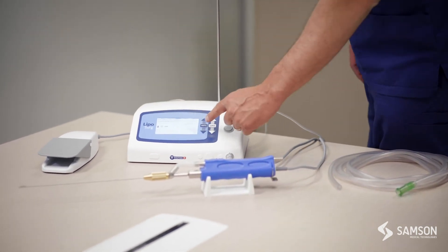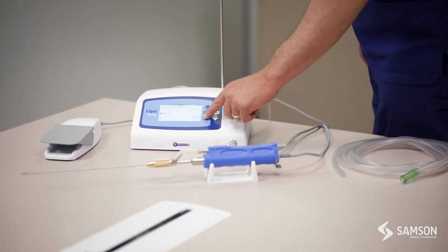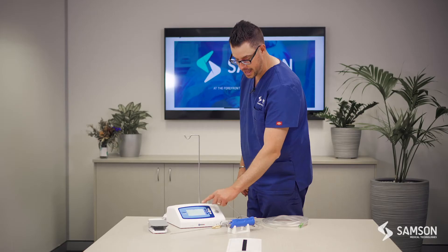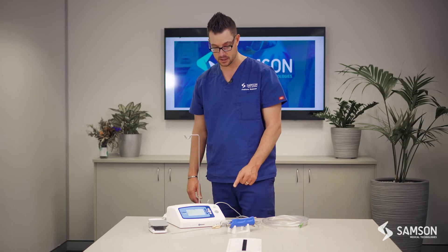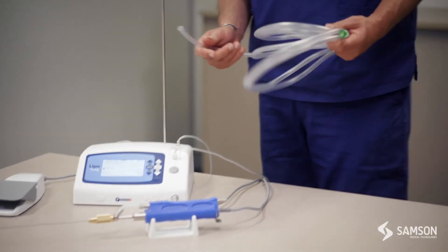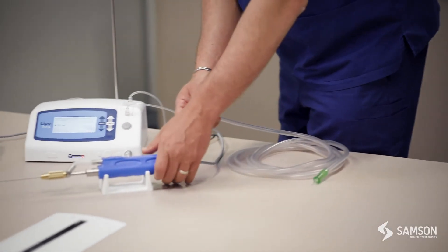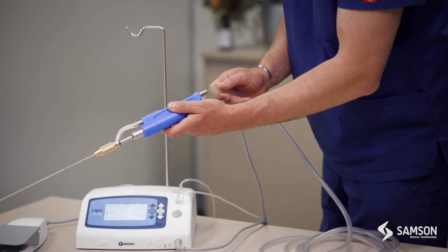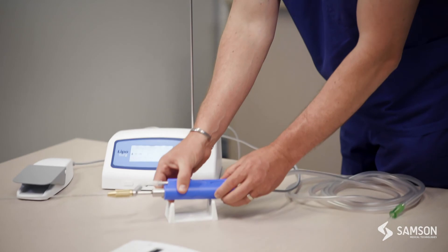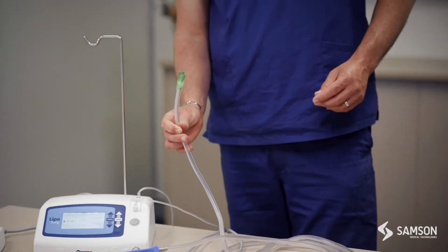We then select on our LipoSurge 'infiltration' or 'infill' and toggle up and down to the desired percentage of infiltration volume. At 100%, it will be infiltrating 400 millilitres per minute. We then move on to our single-use aspiration tubing, connected to the back of the handpiece, which is then connected into your aspiration pump.